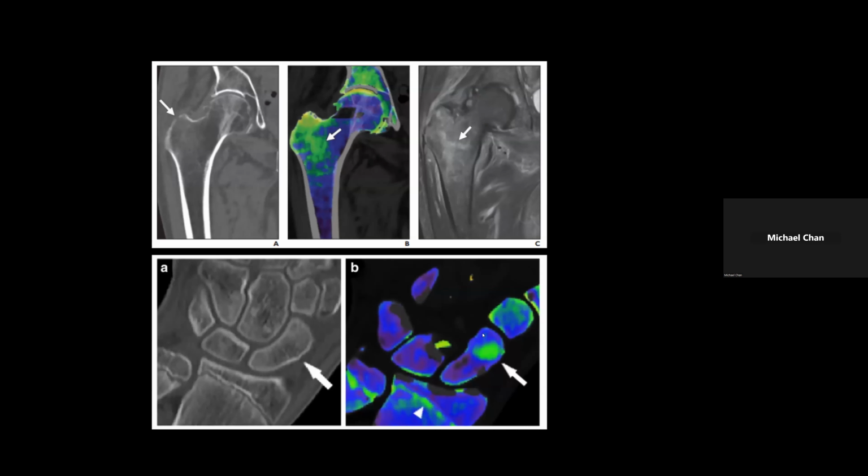And then, like I said, one of my favorite applications, the bone marrow edema. So traditionally, without dual energy CT, bone marrow edema really could only be appreciated on MRI. But with dual energy, we're able to unlock this ability on our CT images.